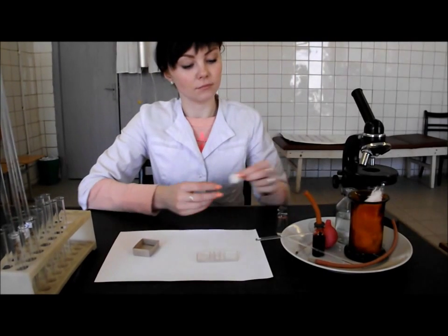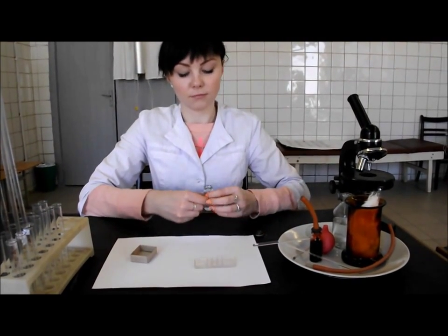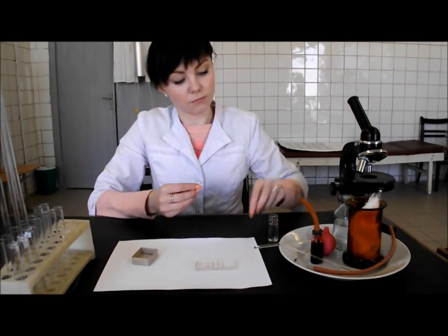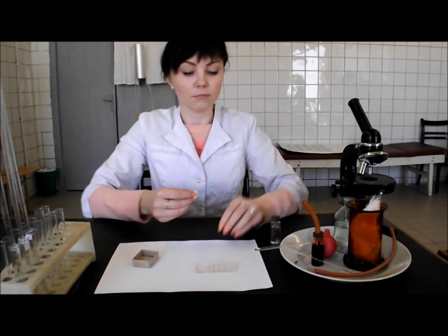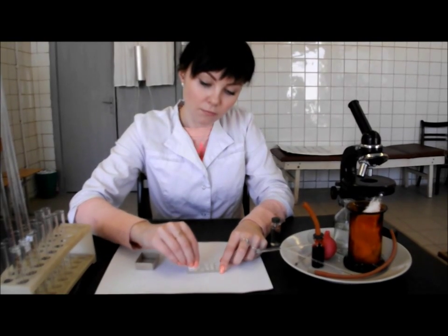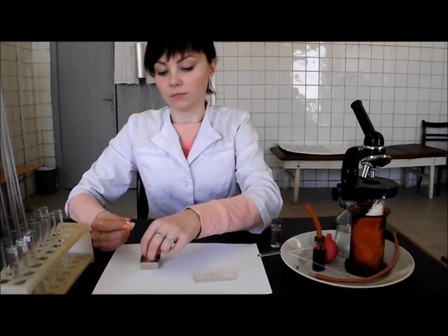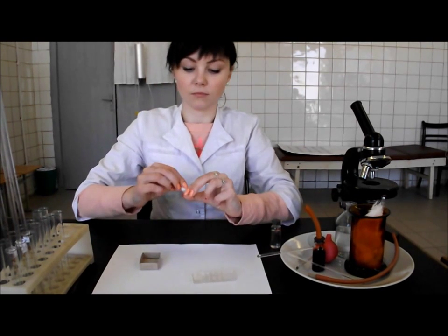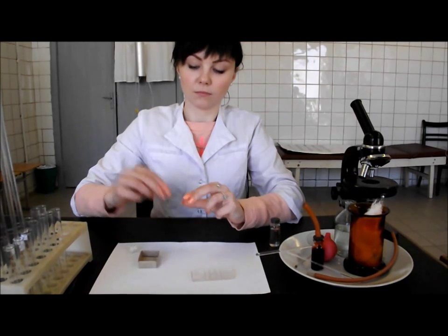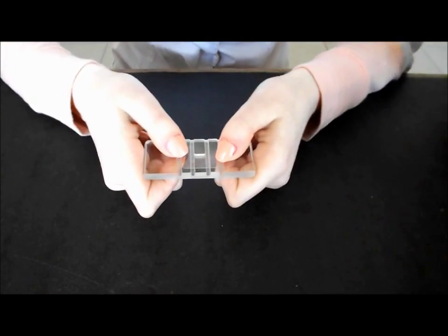First, clean the chamber and the cover glass with cotton wool moistened with alcohol, then dry them. Put the cover glass on the center of the chamber. With the help of thumbs, move the cover glass back and forth until the colorful rings of Newton appear. Leave the prepared chamber on the table.